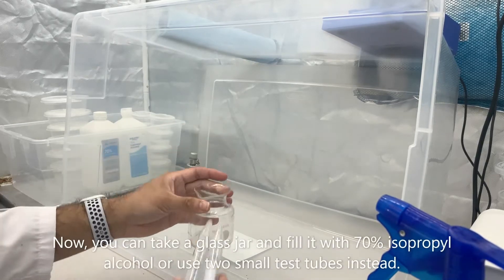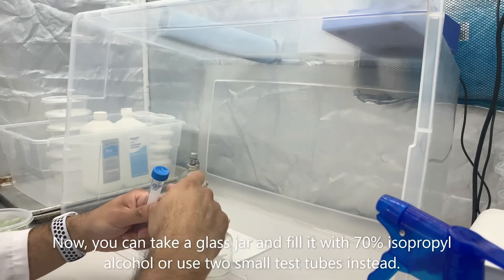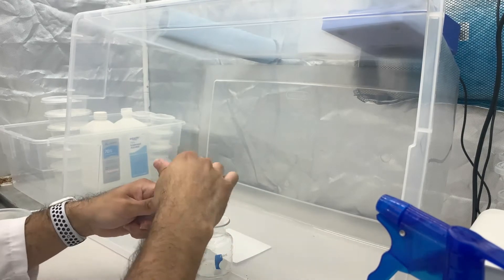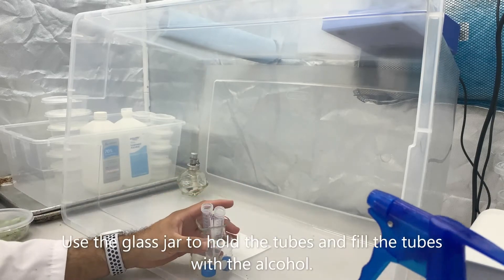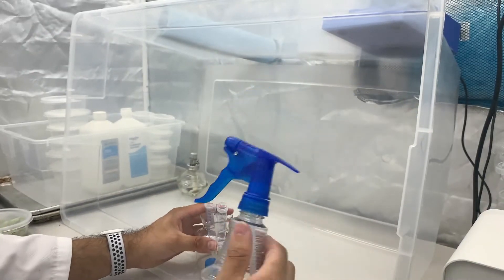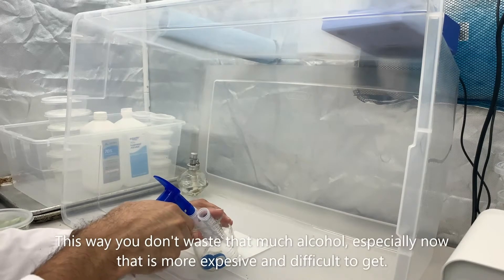In order to keep the forceps nice and sterile the entire time, I would recommend filling up either a cup full of 70% isopropyl or two separate glass jars for each forcep. Today we're going to do two separate test tubes, and we're going to fill it with 70% isopropyl alcohol.